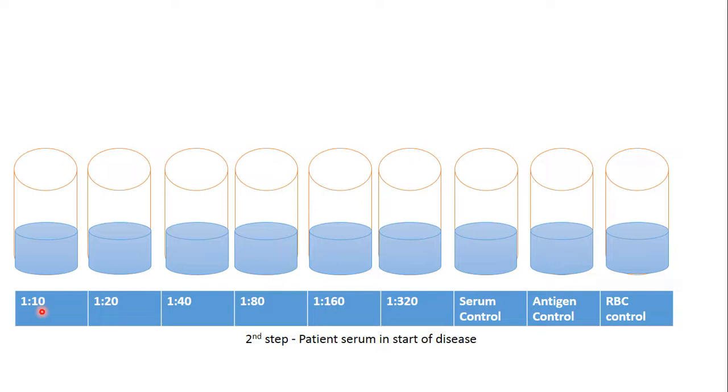We take the original dilution 1 to 5 and add it to the first tube to get a dilution of 1 to 10. We then perform serial dilutions so that every next tube has half the concentration of the previous: 1 to 10, 1 to 20, 1 to 40, 1 to 80, 1 to 160, and the last dilution 1 to 320.